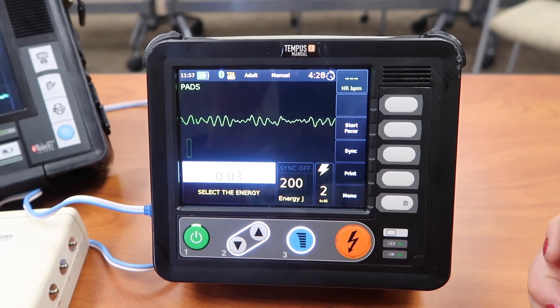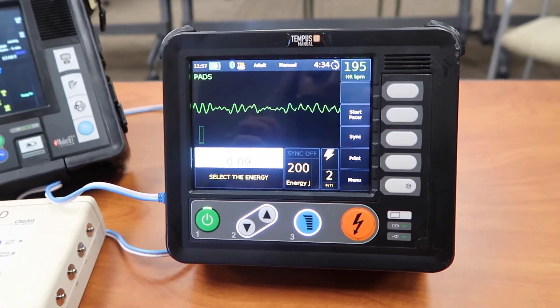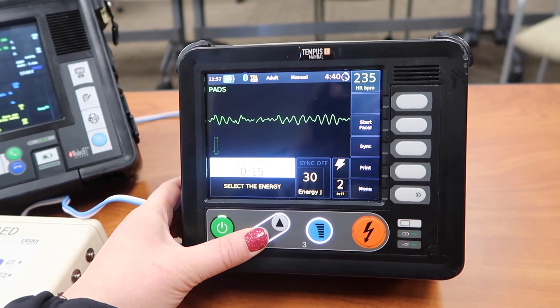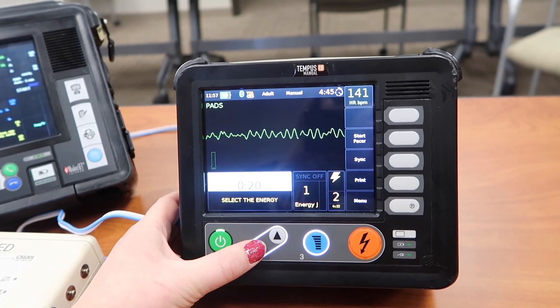The next message is 'select the energy,' which basically means that your defibrillator is ready to select another energy if necessary to defibrillate again. Those gray up and down buttons are how you select your different energy. This goes all the way down to one joule and all the way up to 200 joules.